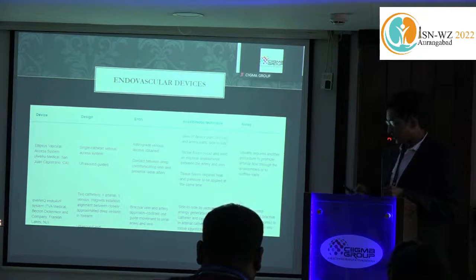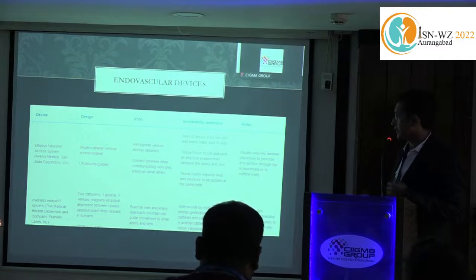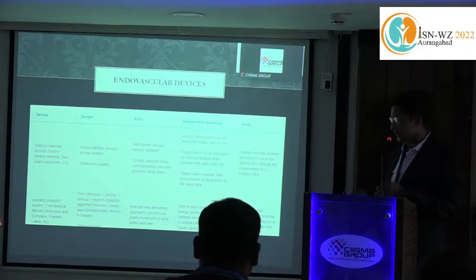So there are 2 systems. One is the Ellipsys vascular access system, and another is the Everlinq endoAVF system. These are 2 systems. I think presently this is available in Canada and 2 centers in the USA.